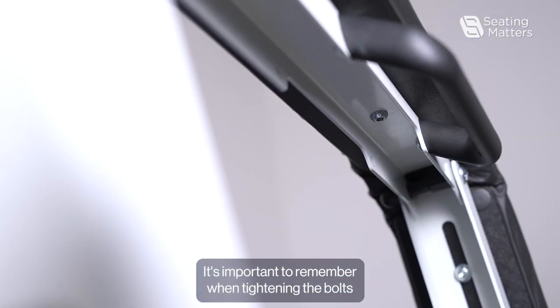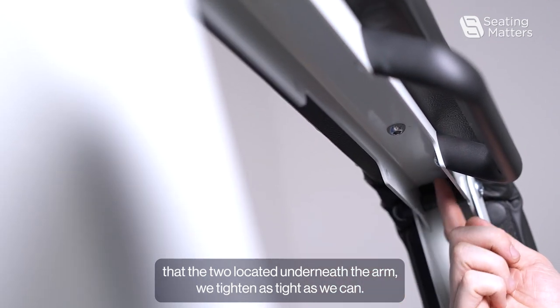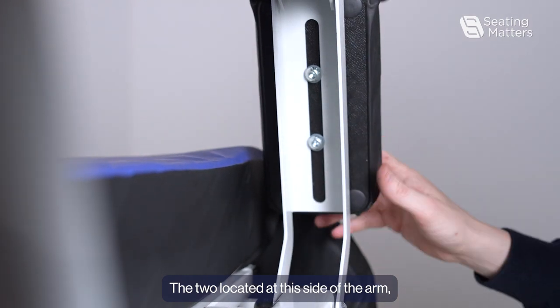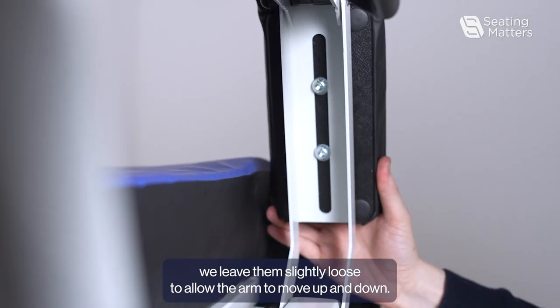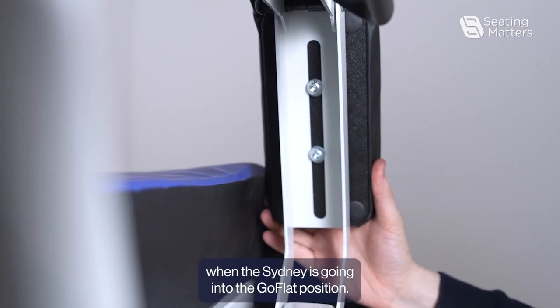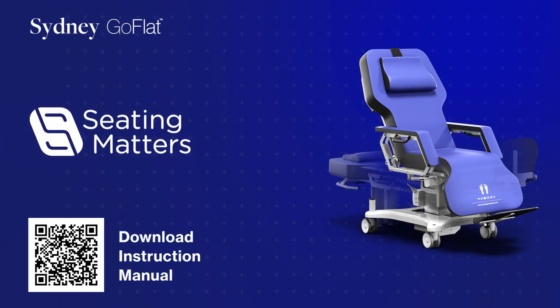It's important to remember when tightening the bolts that the two located underneath the arm, we tighten as tight as we can. The two located at the side of the arm, we leave them slightly loose to allow the arm to move up and down when the Sydney has gone into the go flat position.